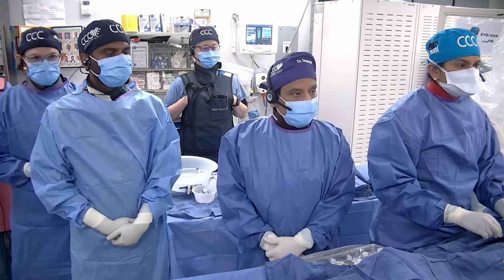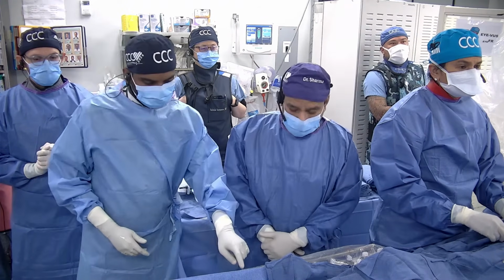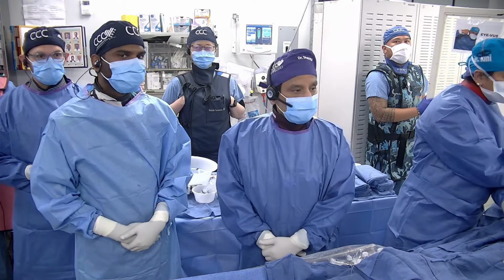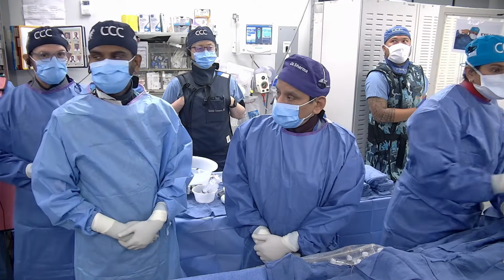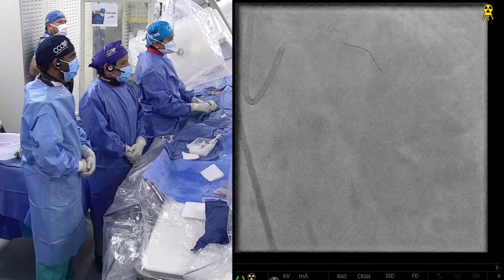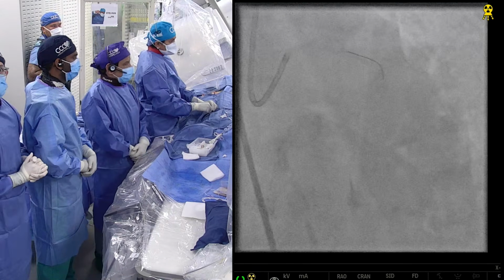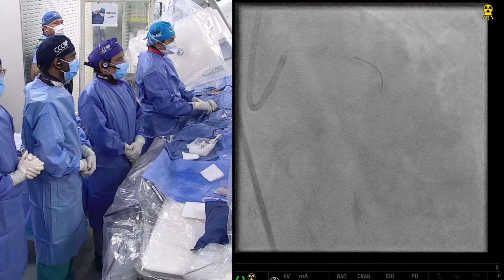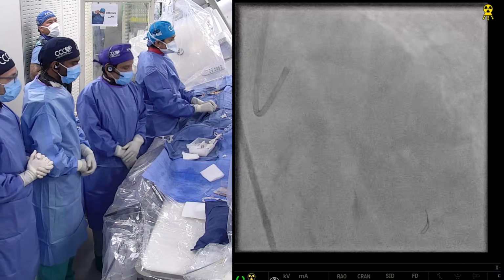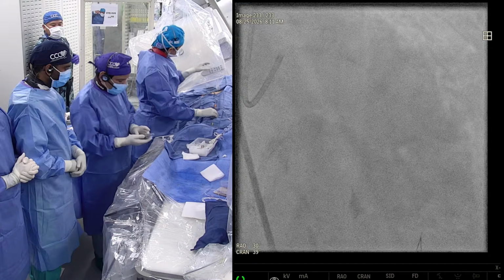It may look a little simpler case on the angiogram, but we thought that some tortuosity and some few things. Just to say that we try to present some challenging cases. That's been our goal. Now, many times those challenging cases are really complex cases with LV dysfunction. And this patient is a little different, but in terms of some tortuosity of the vessels.